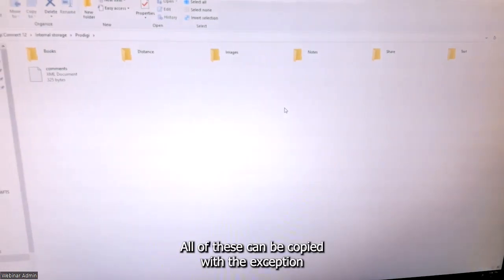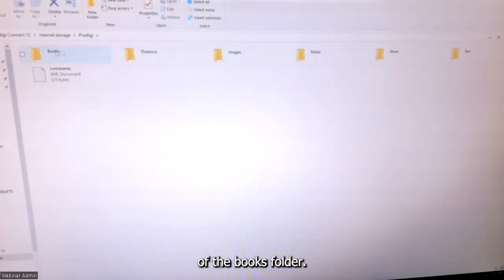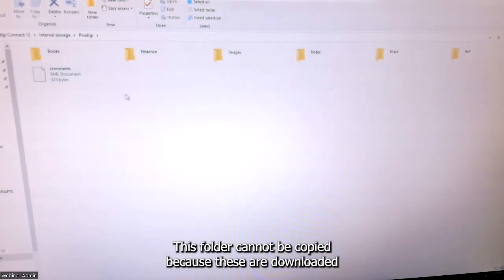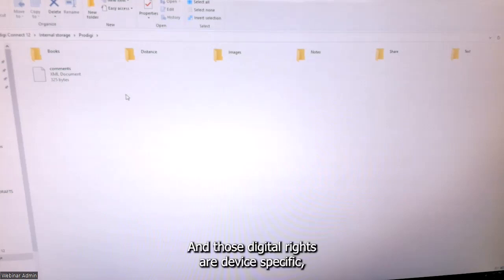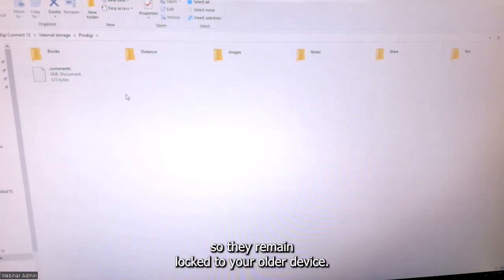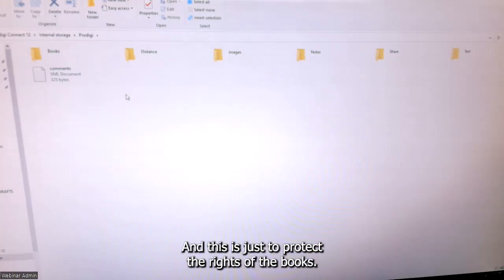All of these can be copied with the exception of the books folder. This folder cannot be copied because these are downloaded books from Bookshare that have digital rights management associated with them, and those digital rights are device specific — so they remain locked to your older device and cannot be copied from one device to another. This is just to protect the rights of the books.